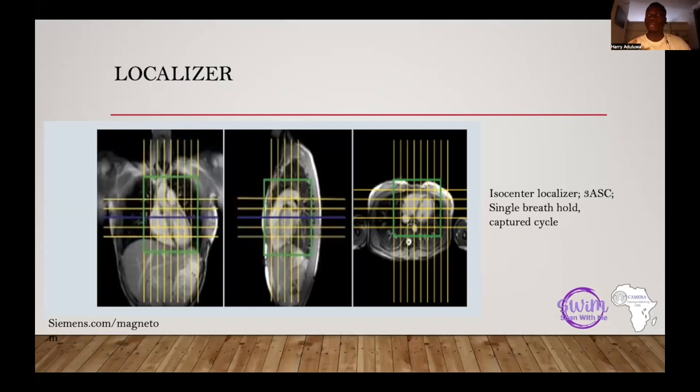They are very responsive to holding their breath during expiration. But when you ask them, breathe in, breathe out, breathe in and hold your breath, there's every tendency that the patient could take a little bit of drop in breath. And when there's a drop in breath, you are calculating maybe pre and post contrast for the radiology, there might be that little difference in figures you are getting. But either way, that's for one.